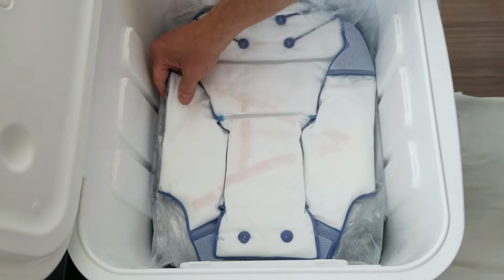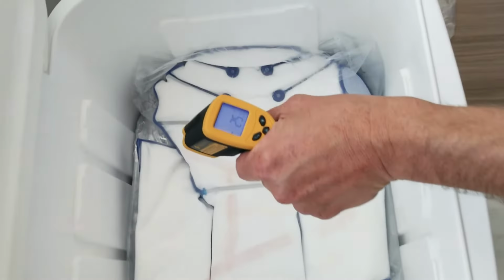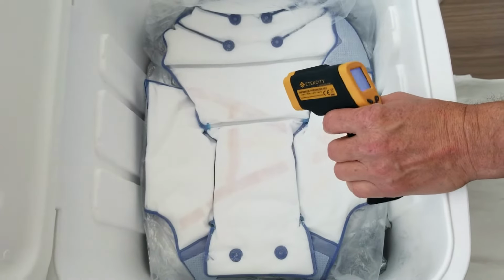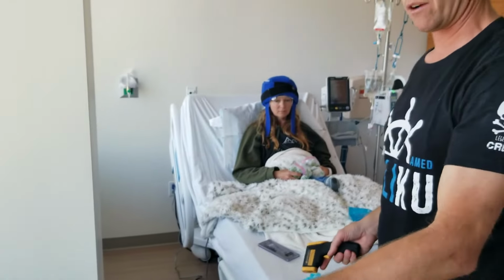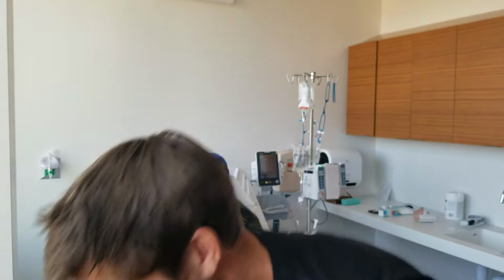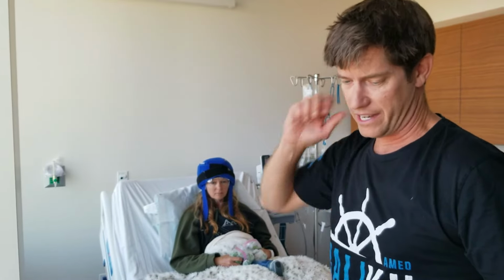You want to check to see if there's maybe some cool spots. So this one's about 21, 25. You might just want to throw some dry ice in that little spot right there, maybe in 10, 15 minutes, to cool it off a little bit. I close it up, and then when my timer goes off, I'll take that one out. It gives me a couple minutes to have it warm up a little bit, massage it, get it ready for the next cycle. And then we're actually going to be going home right now.